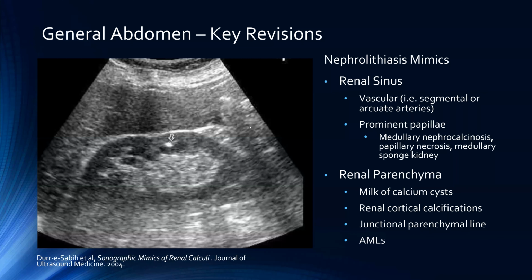So here on the left, you can see this is actually a case of an interlobar artery that's coursing along the side of the medullary papilla. It's kind of hard to appreciate on this image.